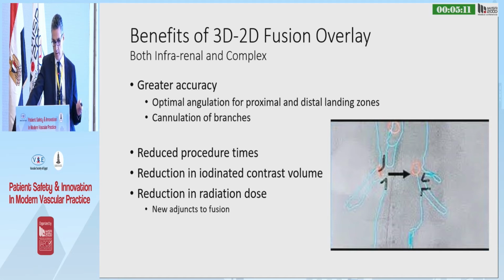The other thing, as I mentioned, is that it makes cannulation of branches easier in complex repairs. There is increasing evidence to show that it reduces procedure times, it reduces the volume of contrast required, and it reduces the radiation dose.